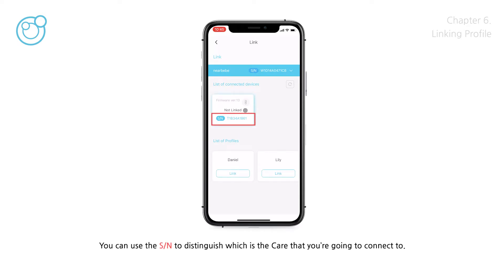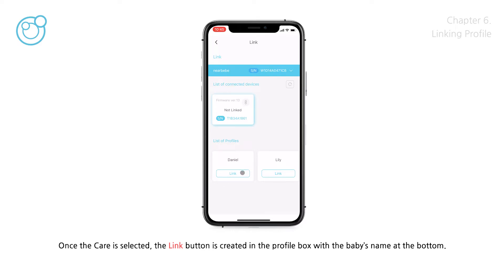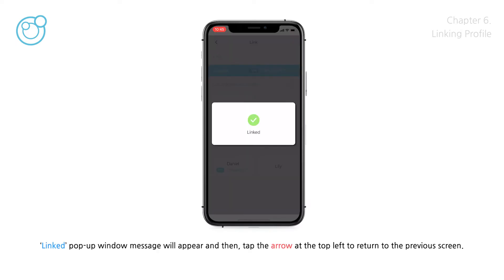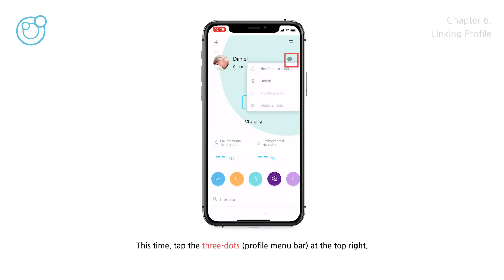Three units of care can be connected to one station. You can use the serial number to distinguish which care you're going to connect to — this number can be checked on the label sticker at the top of the care's clip. Once the care is selected, the link button is created in the profile box with the baby's name at the bottom. Once you tap the link button, care and the baby will be connected. A 'Linked' pop-up window will appear, then tap the arrow at the top left to return. If the main screen displays updated information, the link is successful.